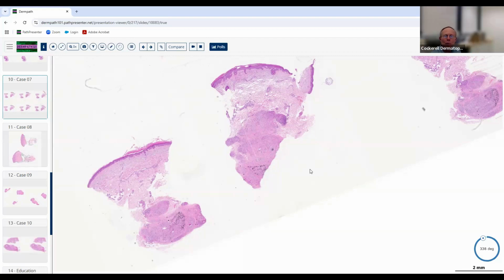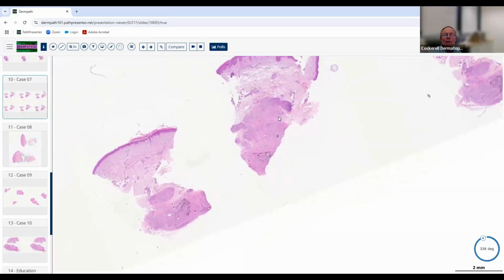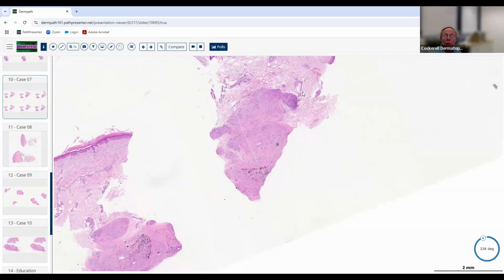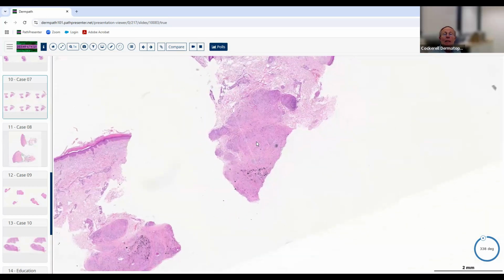We know that there are 5 major patterns of granulomatous inflammation. There's suppurative granulomatous, usually seen with an infectious process. There's foreign body, there's tuberculoid, there's sarcoidal, and then there's palisaded. And so at this power, we would say that if it's granulomatous, it's going to be sarcoidal, round epithelioid granulomas. And here we don't really see too much in the way of a lymphocytic infiltrate associated with it. So we say, well, maybe this is going to be sarcoidosis itself. Maybe it is. But there's something else here.